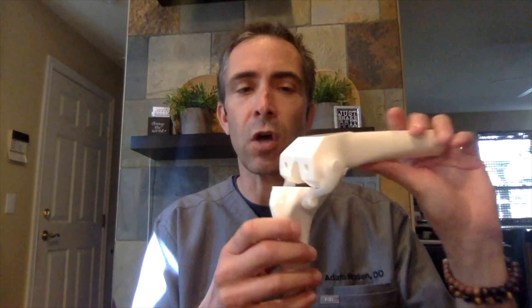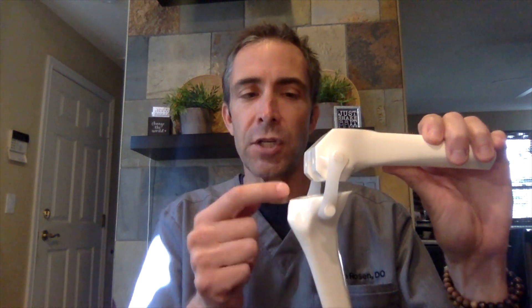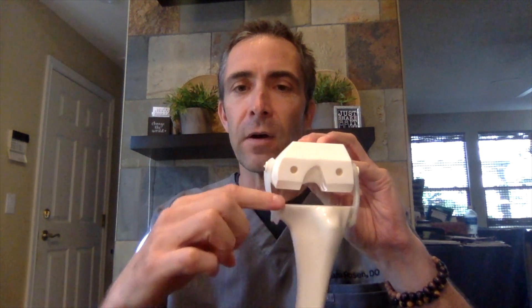Now the bone is prepared, and it looks something like this — this is a sawbones replica. What you're seeing here is the end of the thigh bone has been cut flat, the top of the shin bone is cut flat, these angled cuts called chamfers on the front and back, and the back of the femur is also cut flat. From the front, you can see that the shin bone part has also been cut flat.